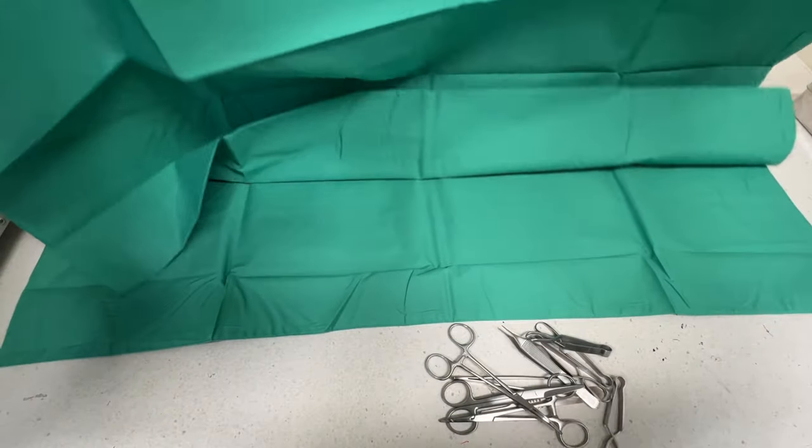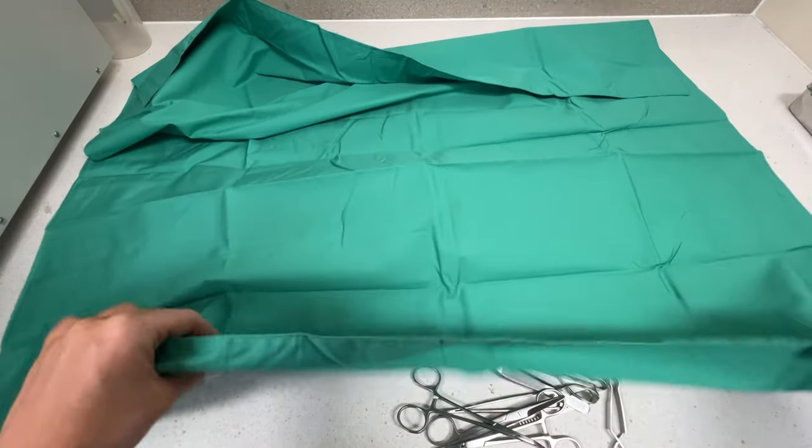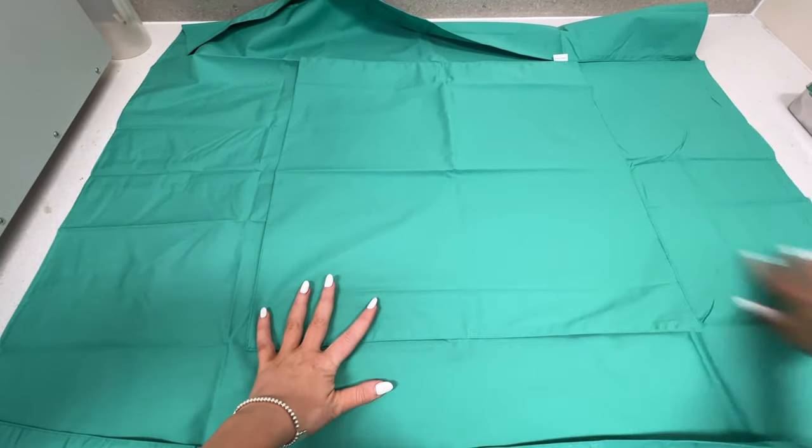In this video we're going to go over how to pack a surgical kit. This kit that I'm packing right now is just a small stitch kit. I am missing a couple of instruments but this is just purely for example.